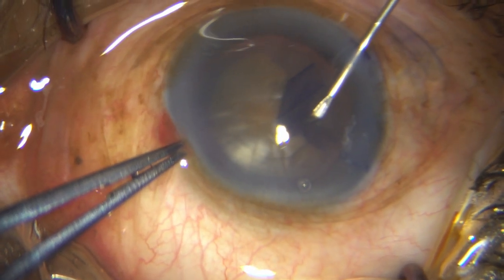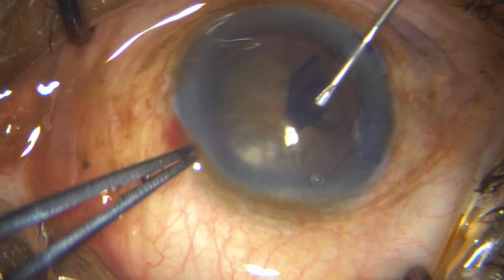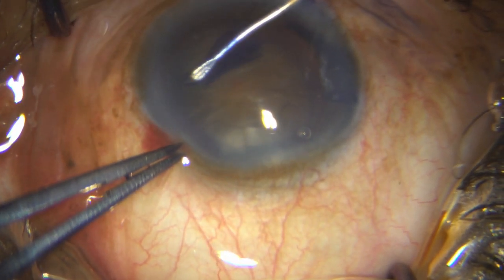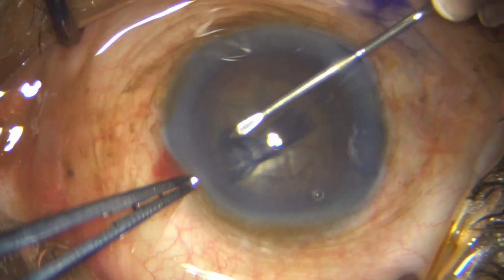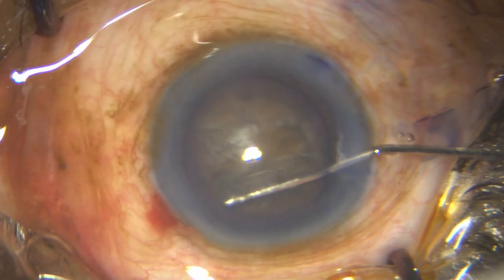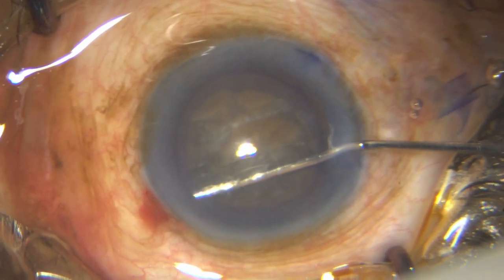Sometimes in the quest for a large rhexis, in that over-enthusiasm, you may even lose the rhexis. Finally, I did not — I achieved an adequate rhexis, but I would have liked it to be maybe one millimeter larger than what I got.